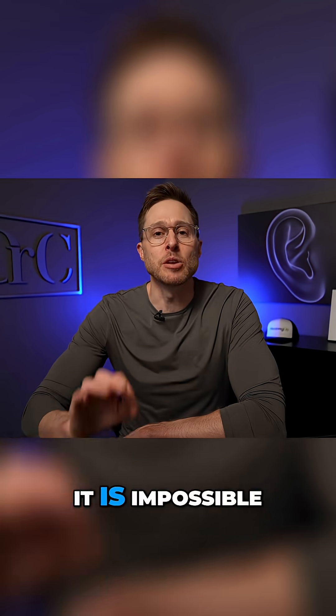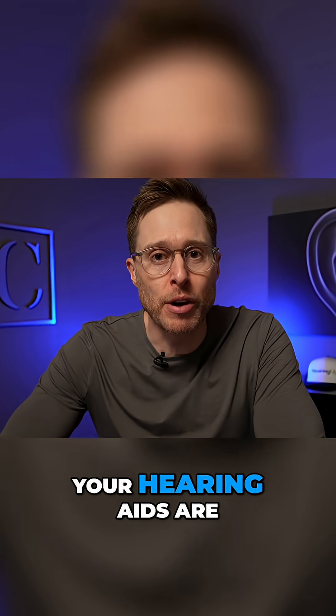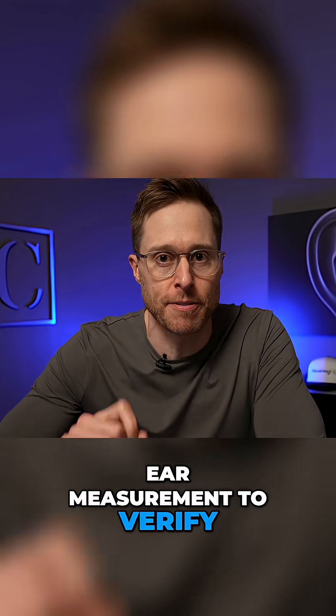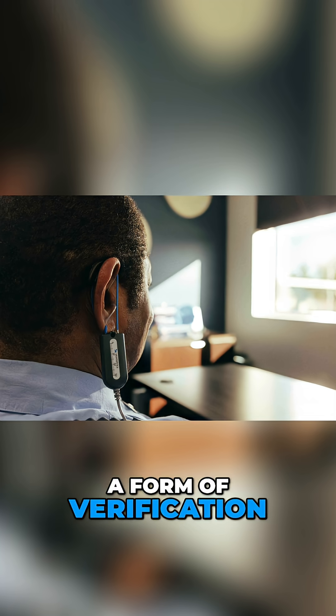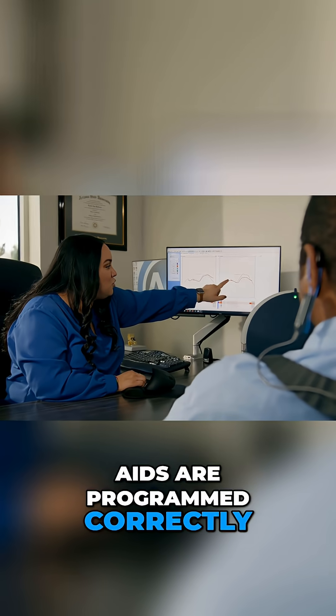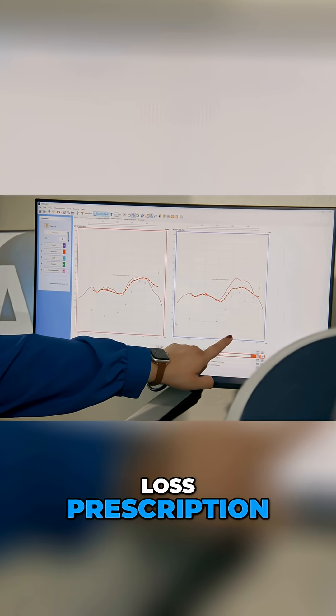I want to be very clear when I say this: it is impossible to know if your hearing aids are programmed correctly unless you use real ear measurement to verify it. Real ear measurement is a form of verification that allows us to identify if your hearing aids are programmed correctly to match your hearing loss prescription.